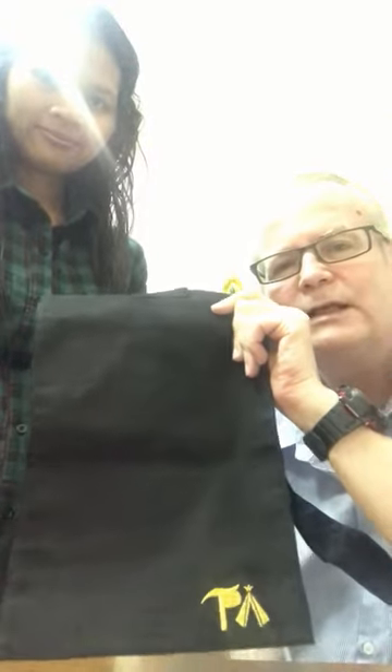Hi there. I am Steve and this is May from the TP bag catheter bag company. We'd like to introduce you to the TP catheter bag cover. Very simply, it is 100% cotton, very strong, and the perfect size for a 2000 milliliter catheter bag.